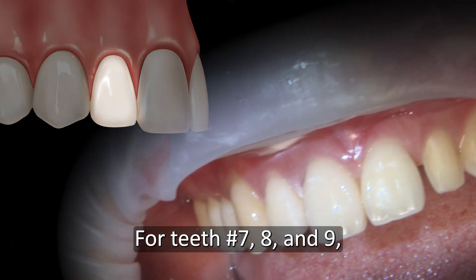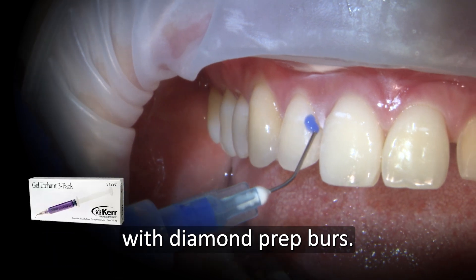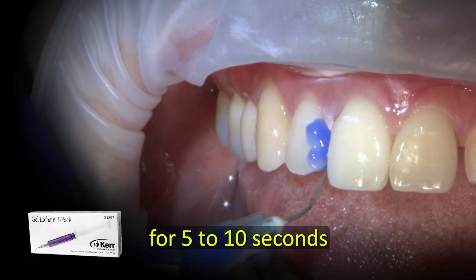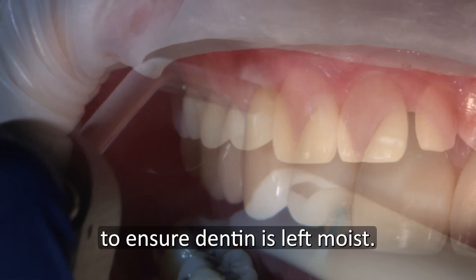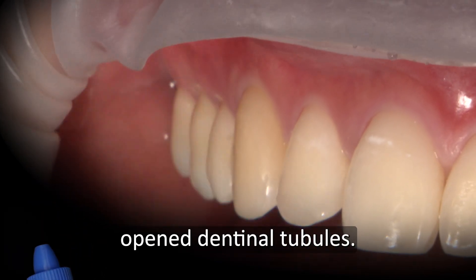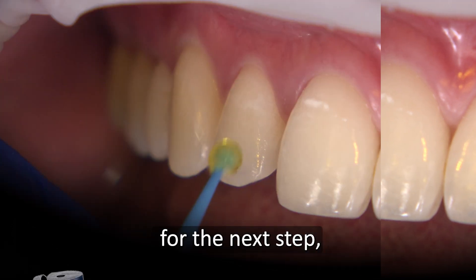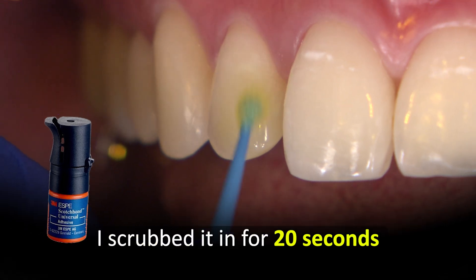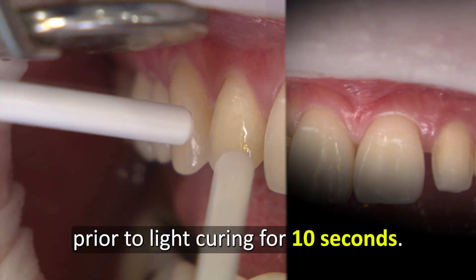For teeth numbers 7, 8, and 9, I first lightly roughened up the enamel with diamond prep burrs. Using 37% phosphoric acid edge, I conditioned each tooth for 5 to 10 seconds and rinsed with lots of water thereafter to ensure dentin is left moist. I like to apply Gluma desensitizer to seal any potential opened dentinal tubules. It also helps disinfect and re-wet the tooth for the next step, which is the Adhesive Agent by 3M Scotch Bond Universal Plus. I scrubbed it in for 20 seconds, air-dried for 5 seconds, prior to light cure for 10 seconds.